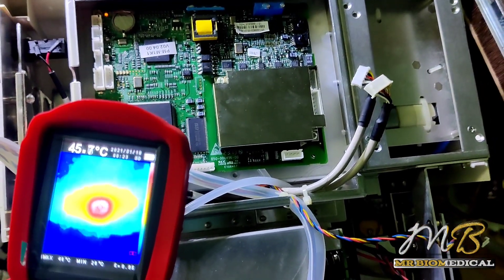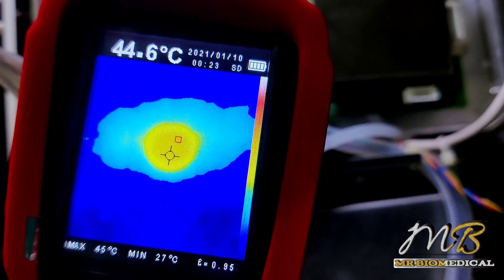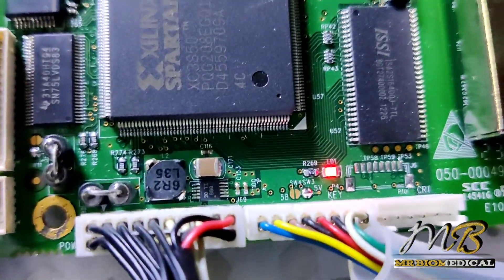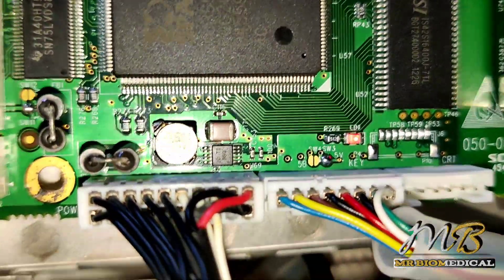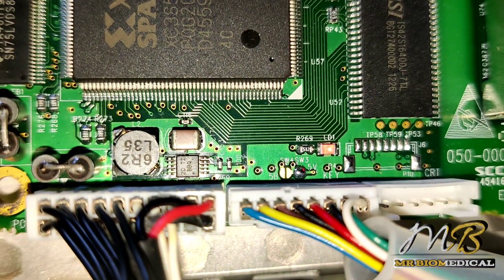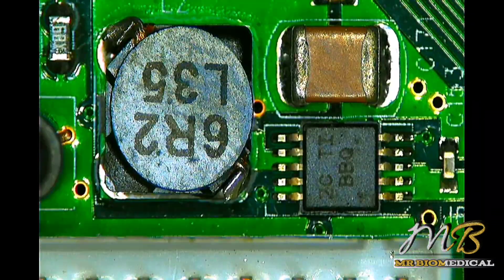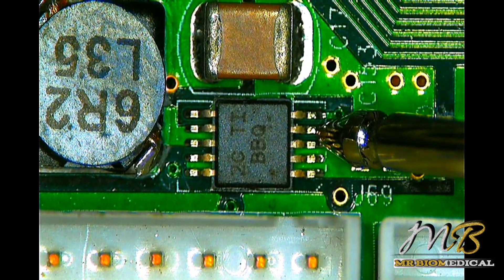I found that the IC near the capacitor appears to be shorted — this IC must be shorted to ground. Let's check it with the multimeter in diode mode. Testing that IC — I'm getting a short on it.